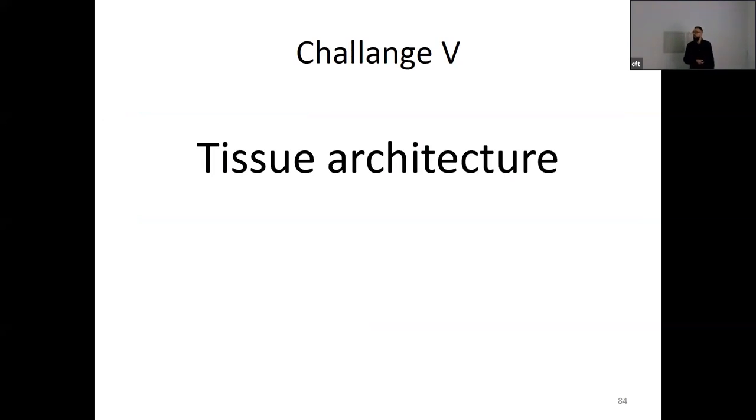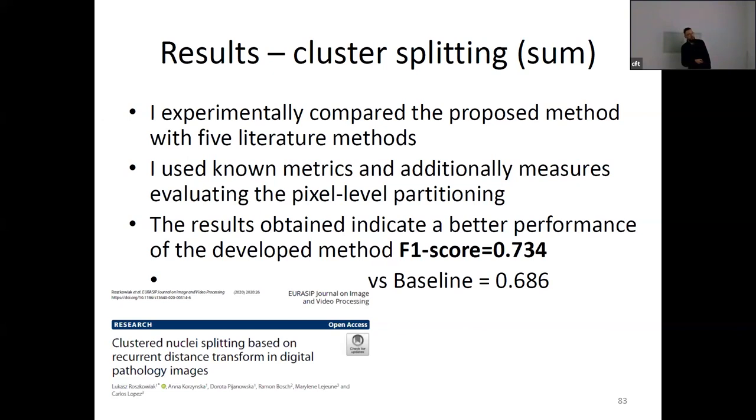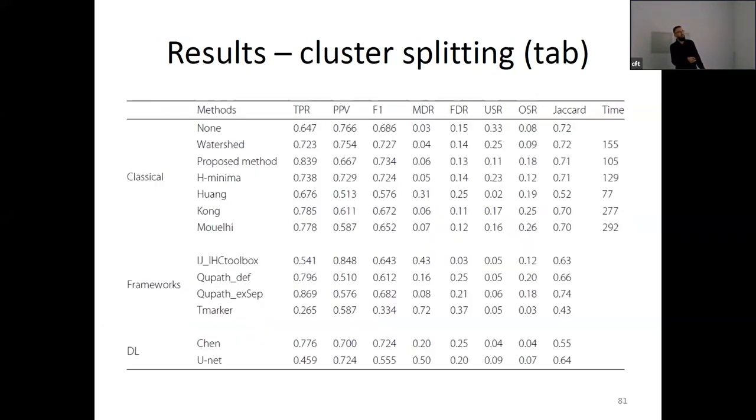And then the error? Yeah. So would you give the number, so it's up and the error? Yes, well, we don't have the number without any errors. We have the baseline that is without splitting. And the basic deep learning methods, like U-Net, for example, they do not provide us with the split. Okay, so this also is very problematic for the basic segmentation methods, also in deep learning. We have the ability to provide instance segmentation, like various different instances of the cells as an output for deep learning, but this was not tested here. Okay, so we don't have the perfect example here. We have only the baseline, without splitting. Okay, so this is none, without any splitting method. Okay, so this is the baseline.